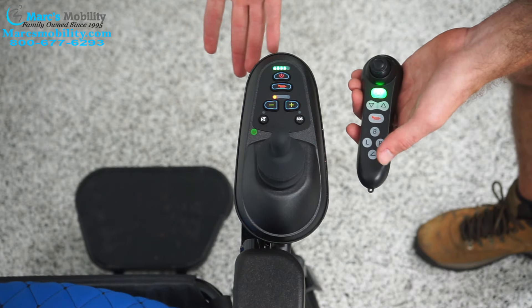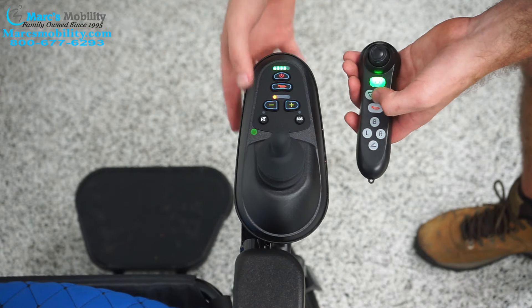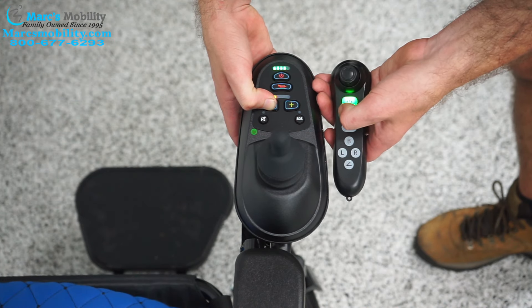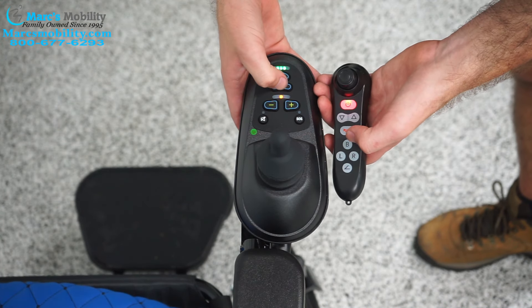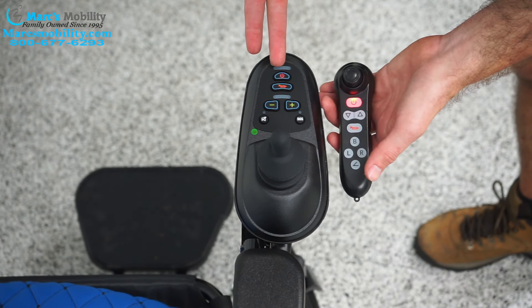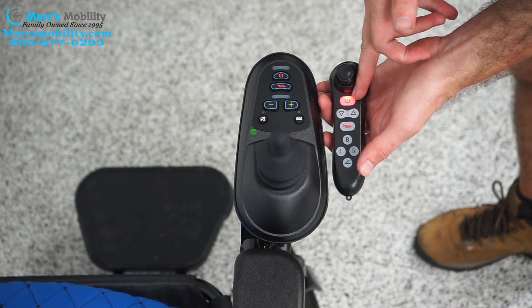It might take one or two presses, but then that should shut your joystick off. Single light, then red — I pressed it twice, the power went off, and I have a single red light here.